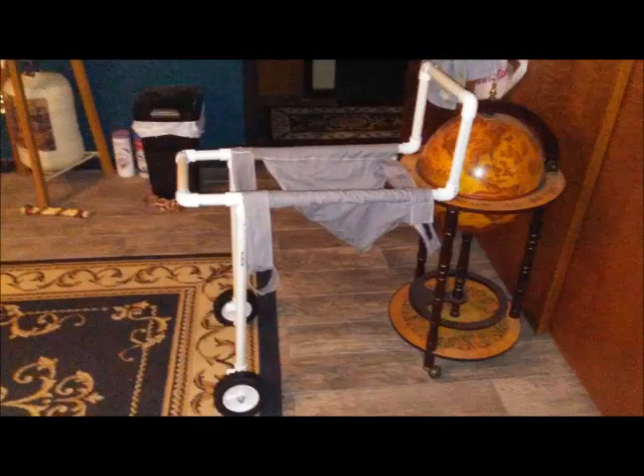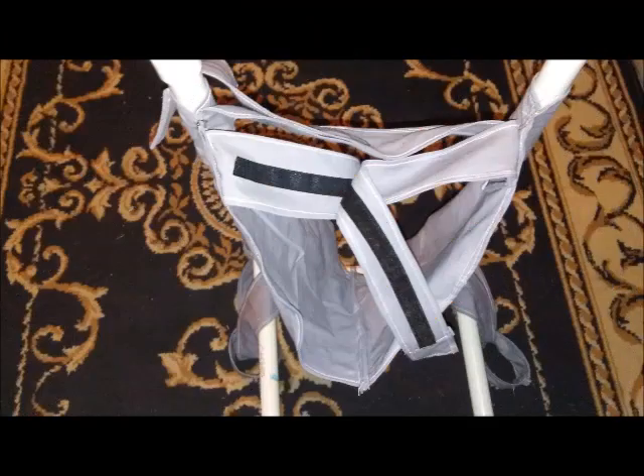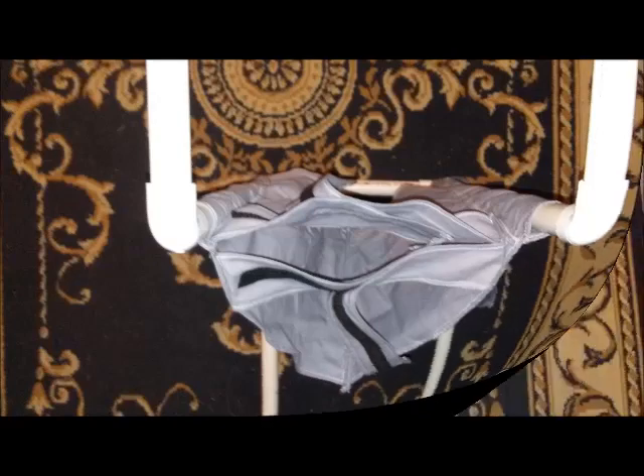This is what it looks like when it's completed from different angles. Once the dog is inside it, there'll be velcro straps over the back and across the chest, and the legs will be in each of those hoops to hold them up so that he can use the facilities. When I tested this, my dog didn't like the second loops — he was okay with the first loop, so I had to remove them. Every dog is different, so they could work for you.